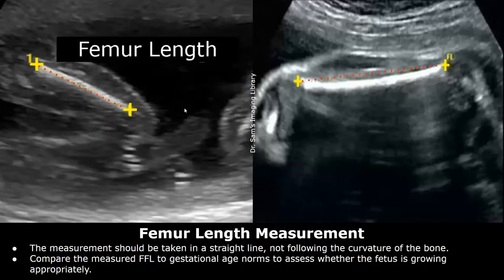Take the measurement in a straight line if you see a curved femur. There is no need to include the curve in the measurement or place any caliper following the curve. You just need to place calipers at both ends of the femur.